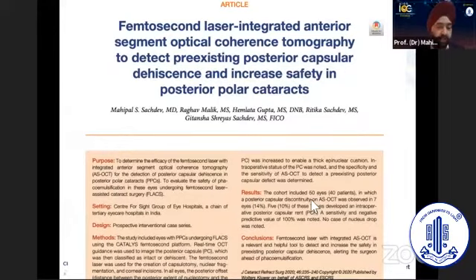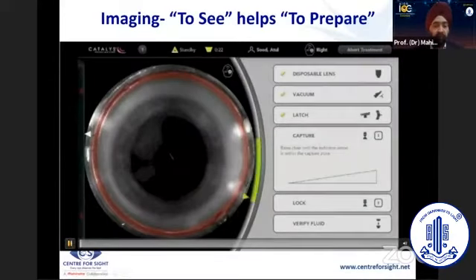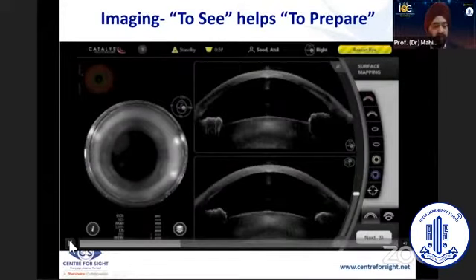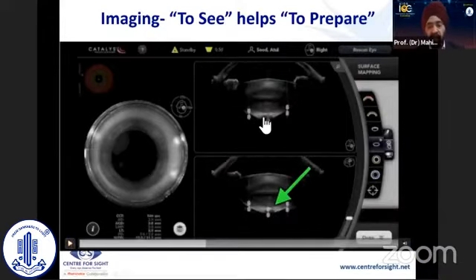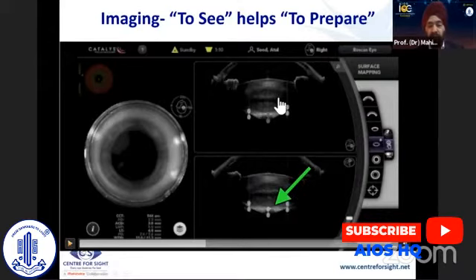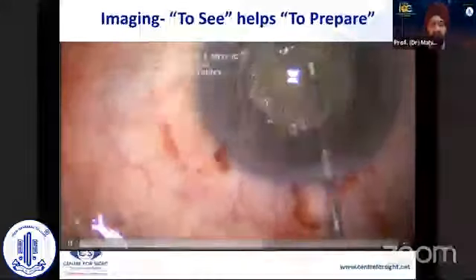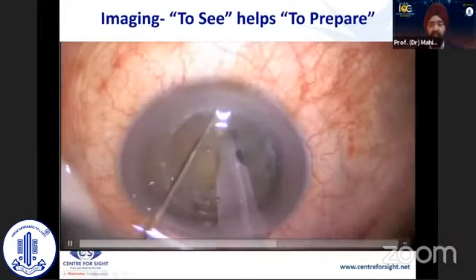I'll just show you that pre-operative imaging is what we are comparing with the intraop OCT, in a thesis for a DNB student, and the results will be out soon. But here what I wish to show you is that this is clearly a defect. There is no posterior capsule, and these bubbles that you get on the Catalys system, you just have to raise the default setting, and you have a clear area where you would not be doing anything with the femto, and you can see the ease of disassembly that you can have.